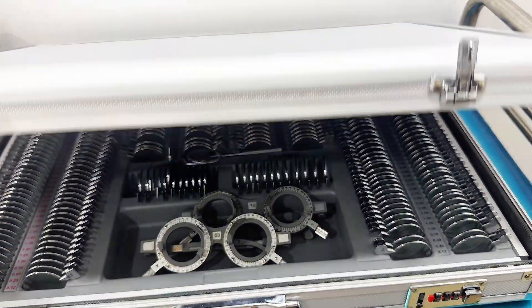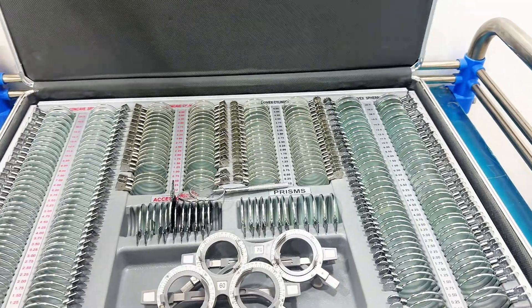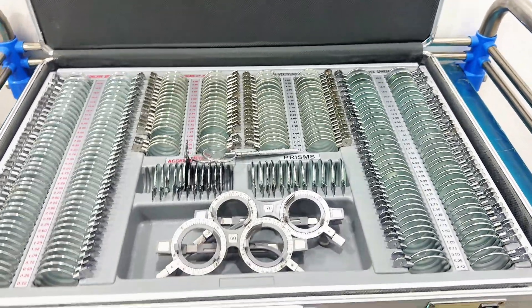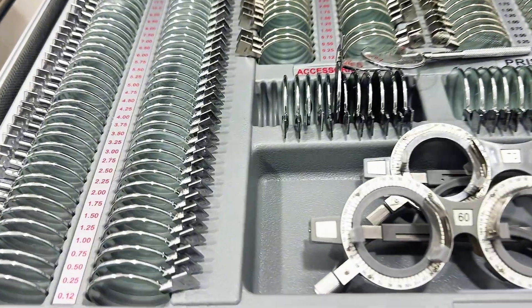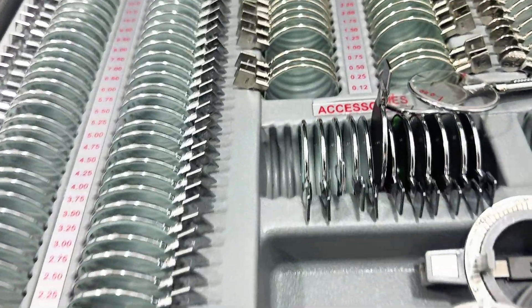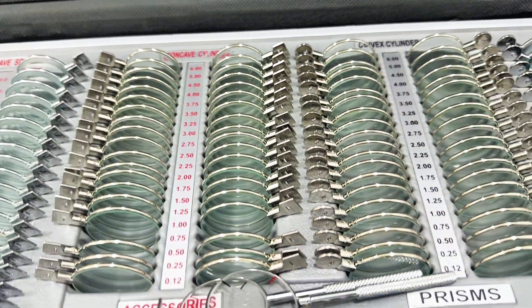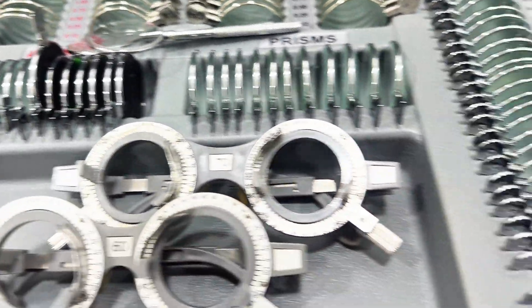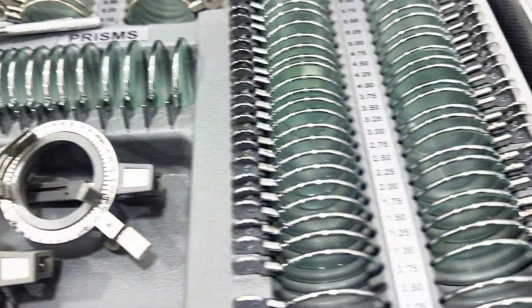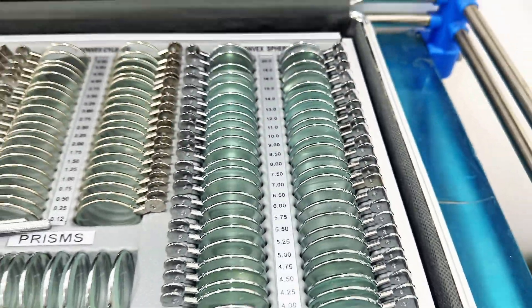The trial lens set is one of the most essential tools in optometry. It's primarily used for subjective refraction and some other visual assessments. It allows you to manually determine a patient's refractive error using trial lenses and the trial frame.